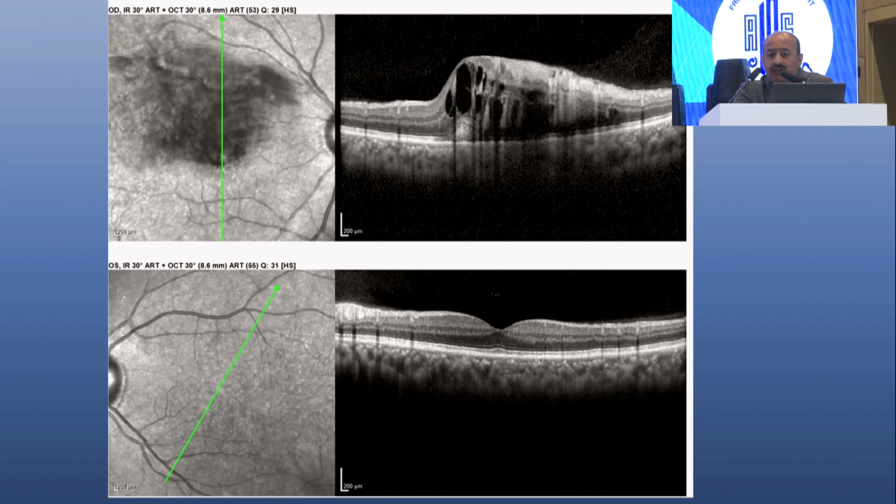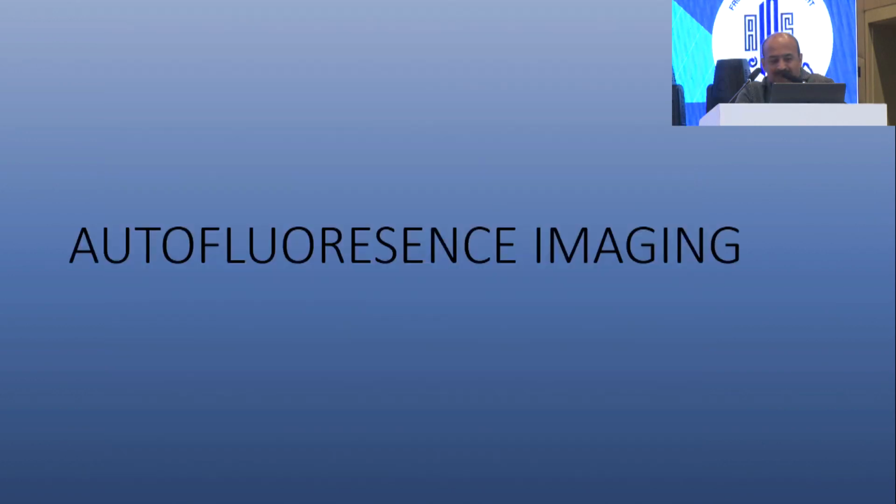Now this infrared imaging is very useful even for the OCT, because with the kind of image which you have of the infrared fundus, you can have very accurate documentation of where the scan is passing through the fundus. So this is a very important addition to the OCT technology, the infrared imaging of the fundus.